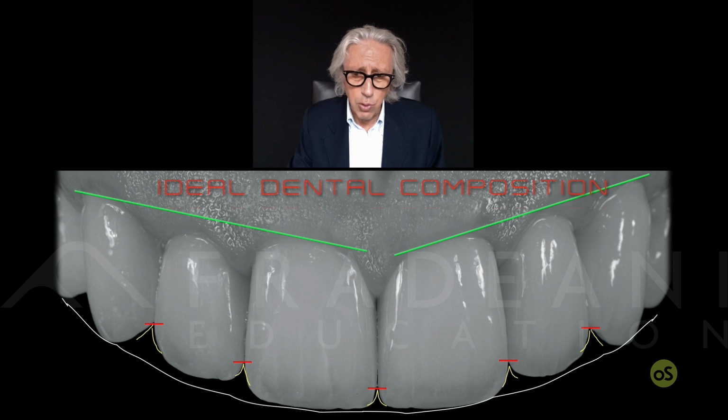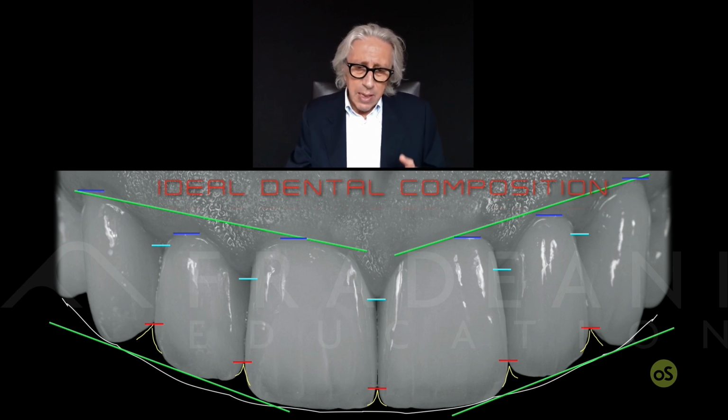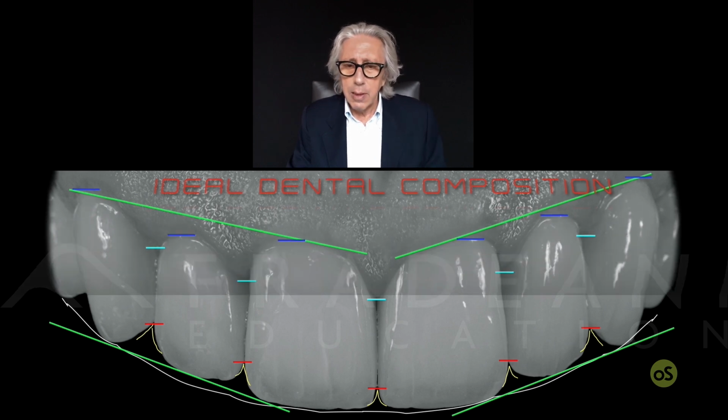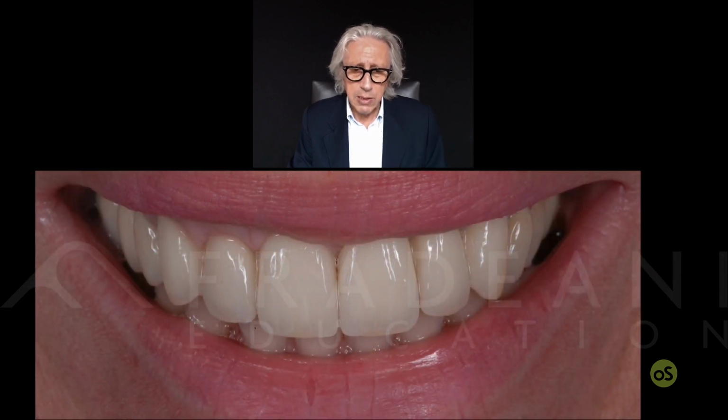Lateral incisor within these 2 lines, incisally and cervically. And then lateral incisor more coronal than central and cuspid. And last but not least, the papilla height. They're not perfect, 100% as they should be, but I believe, having 6 implants close to each other, that is a very good result anyway. That is the case after 1 year. So not a long-term result, but it is still good because 10 years later, it's still in good position. We have maybe some little change at the level of central and laterals, but I believe 10 years later that is really good, especially in the smile of the patient.